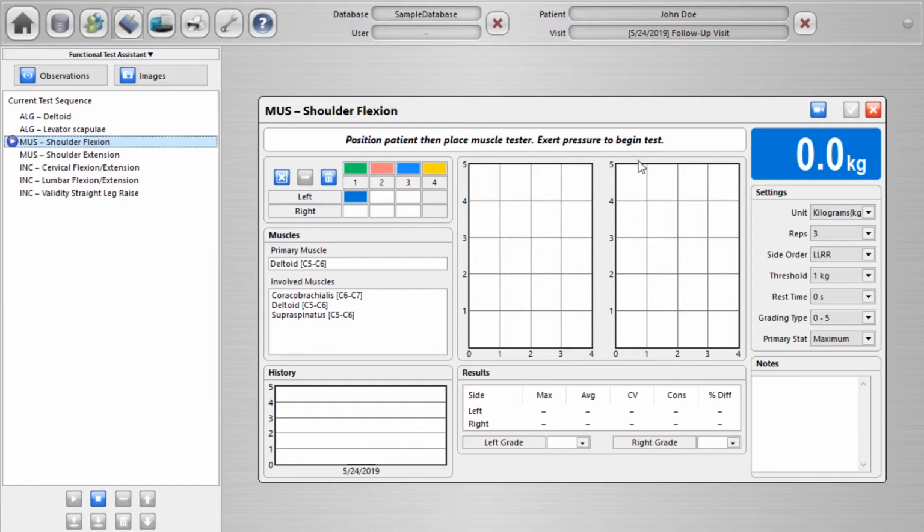In this case, strength is a little bit the same. We're still basing this on force, but we're looking at it more from the patient's performance and the ability to exert force against a muscle strength tester. This is commonly understood to follow the logical progression of something like Daniels and Worthingham's muscle testing, or some of the standard muscle testing that you may be familiar with, doing that by hand.